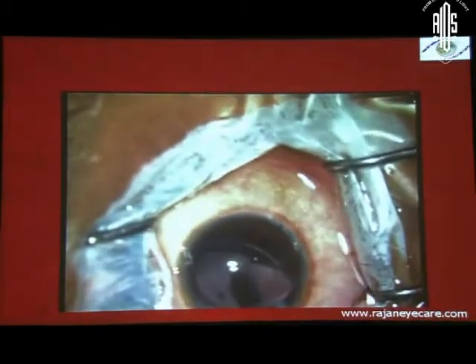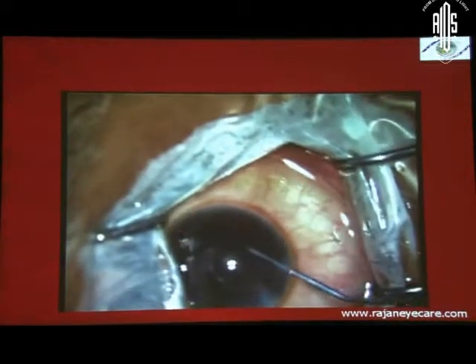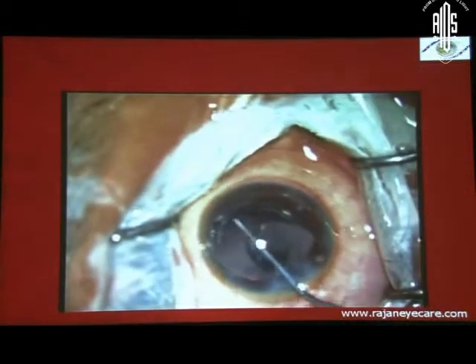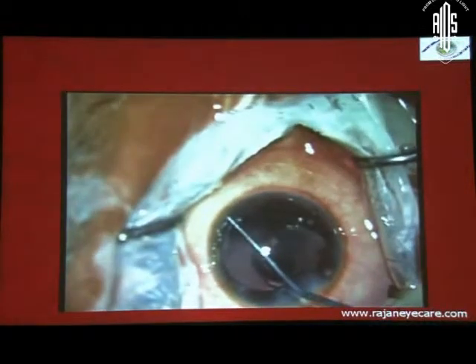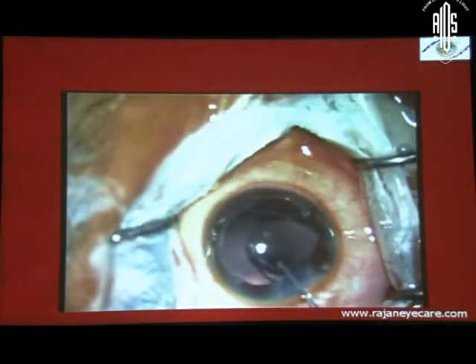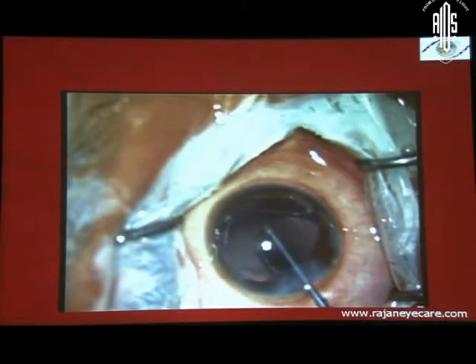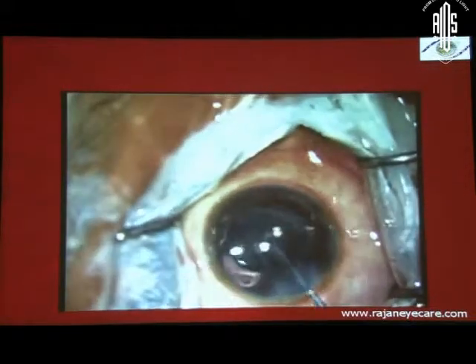In this way, you can bring that one loop out. Once you bring that one loop out, you can go ahead and relocate the remaining loop in the sulcus, because this is a huge PC tear. This is the Aurosys Supraphob lens. The haptics are not as thick as the Alcon SA60, so you can afford to leave these lenses in the sulcus. This is again a relatively younger patient, the patient had a traumatic cataract and is doing well.